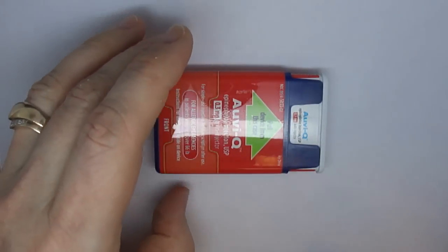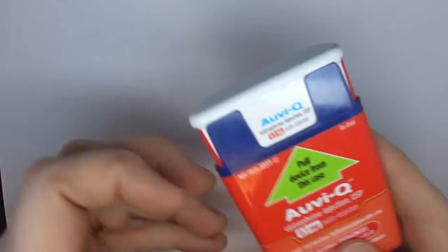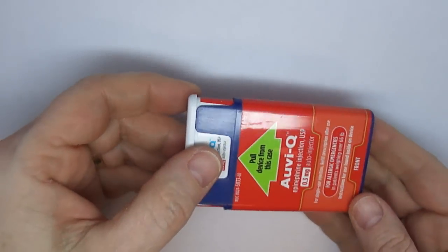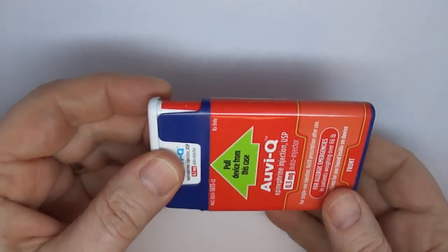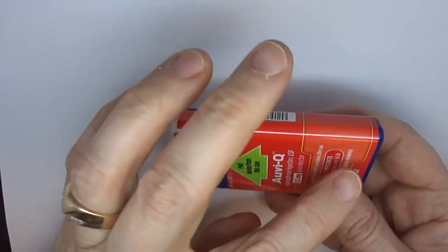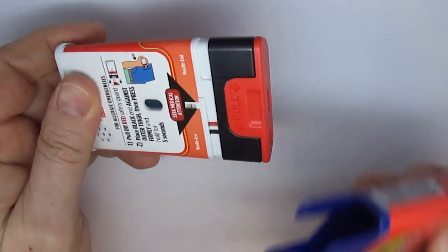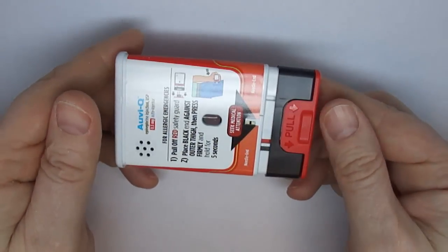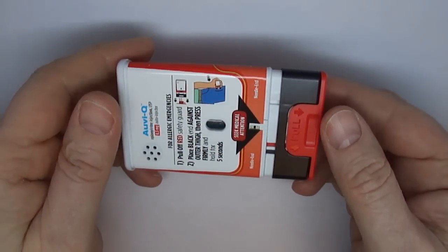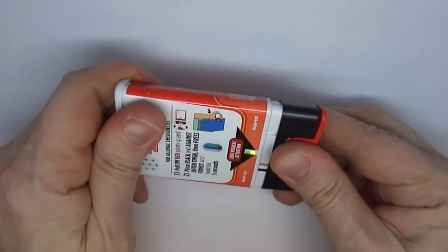So to begin, this is an unused device and I'm going to remove the outer case only briefly because it talks to you when we do, but I just want to show you the activation mechanism in an unused device. Pull off red safety guard. So we're going to pull off the safety guard.